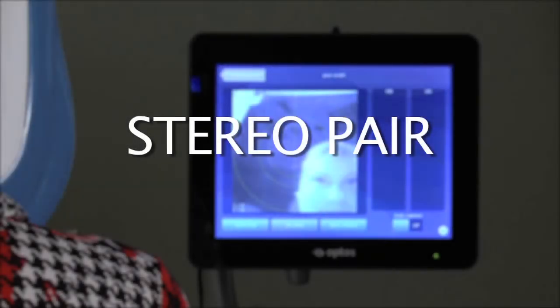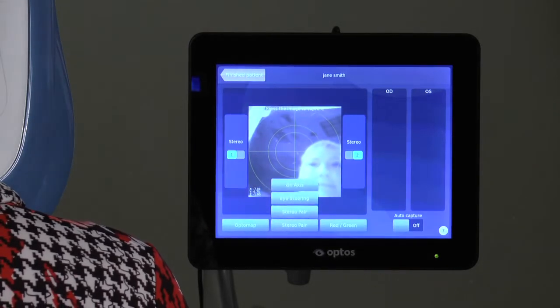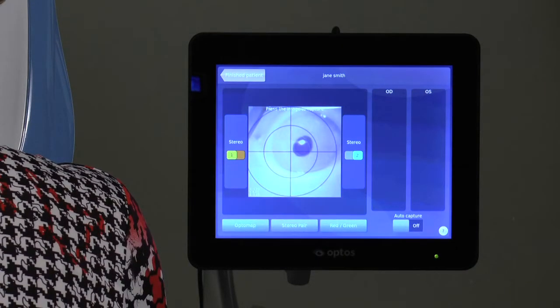Some systems may be configured to capture stereo image pairs. To activate, select Stereo Pair from the middle tab. To start, click on the Stereo 1 Imaging button, which moves the crosshairs left of center.